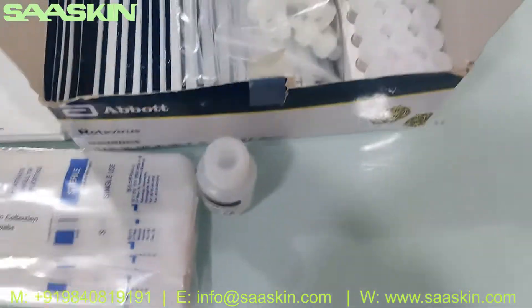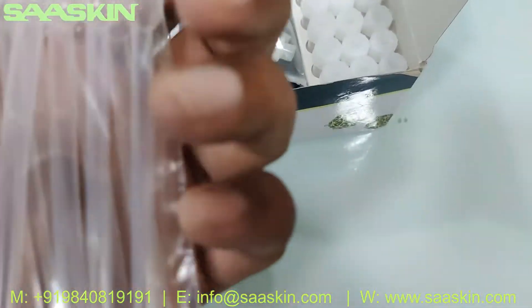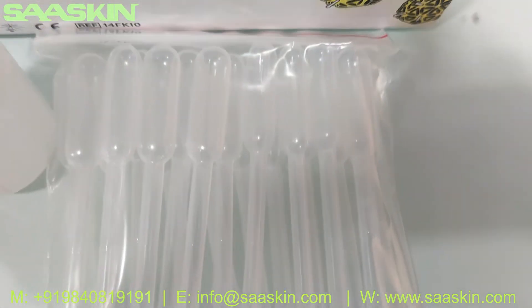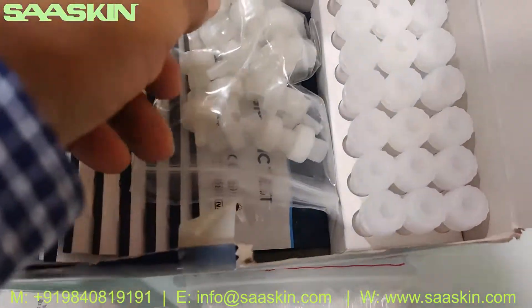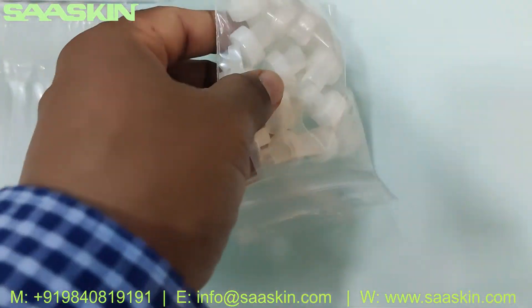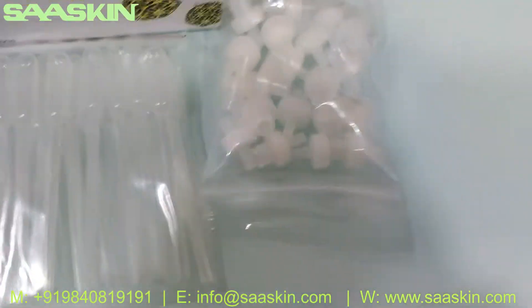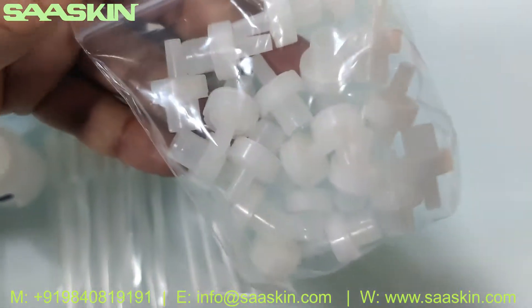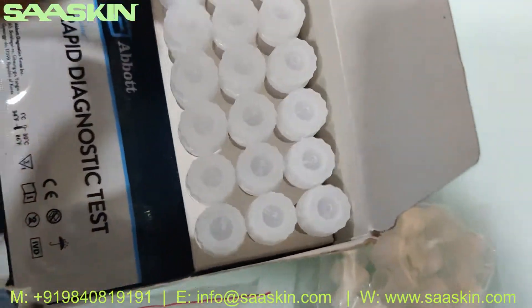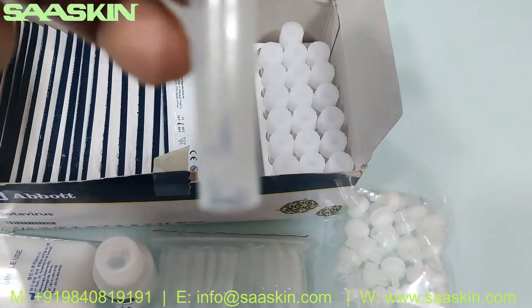Inside you have 20 pieces of capillary tubes. And you have the caps for the buffer tubes — 20 pieces of the nozzle-type caps. Inside you also have 25 pieces of the extraction buffer. Let me show you the extraction buffer here.